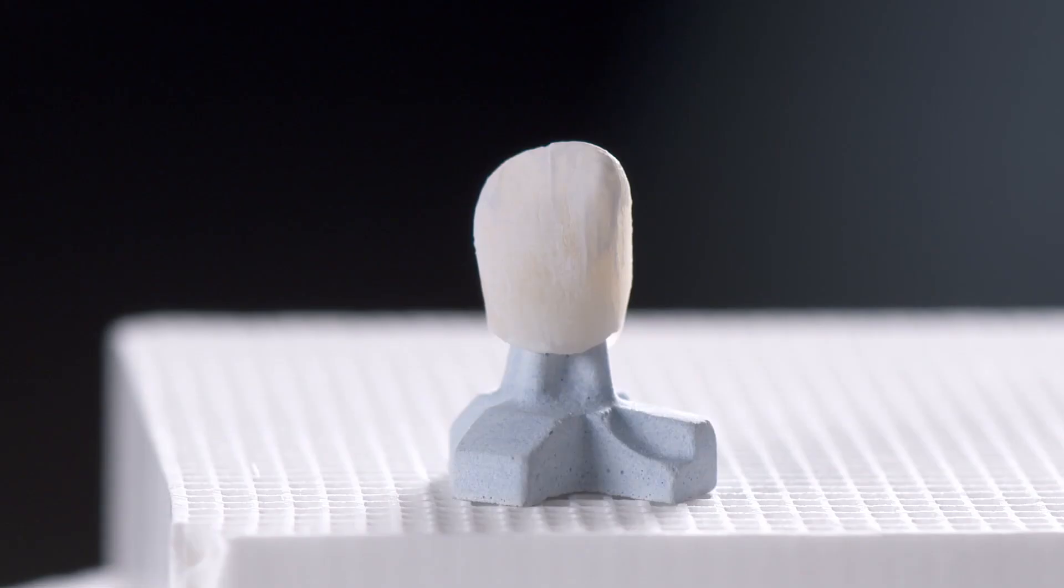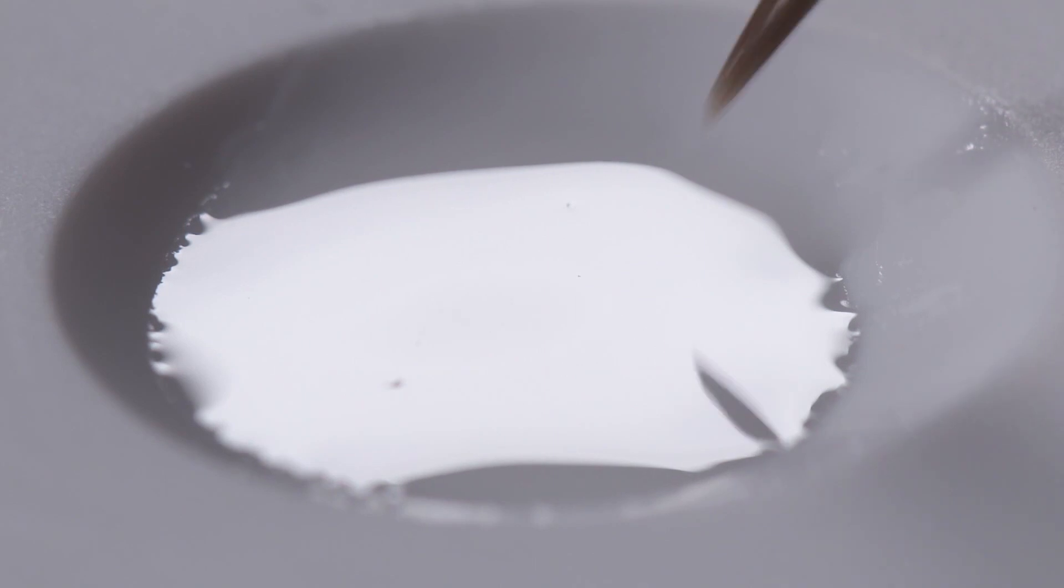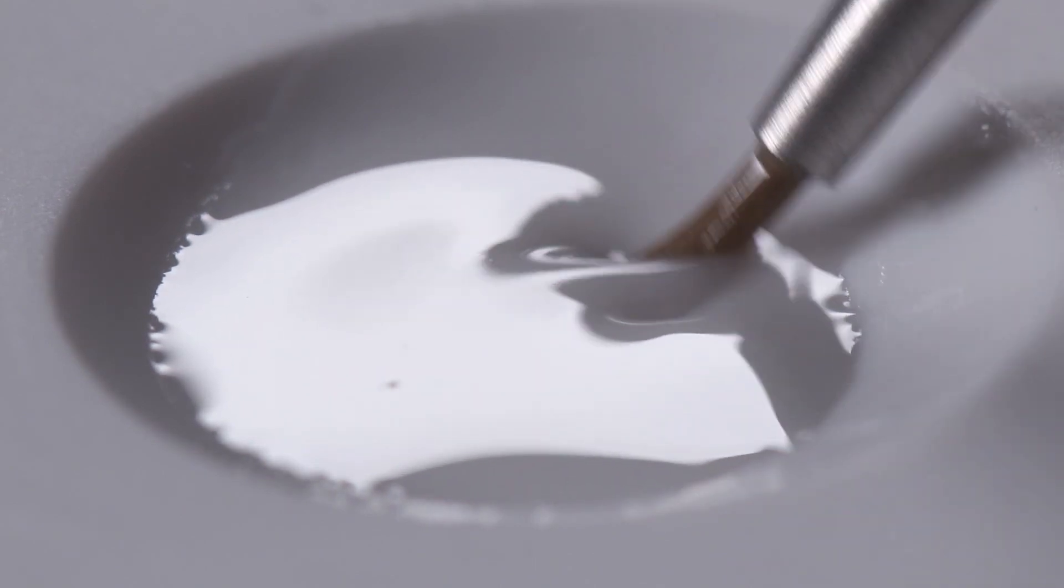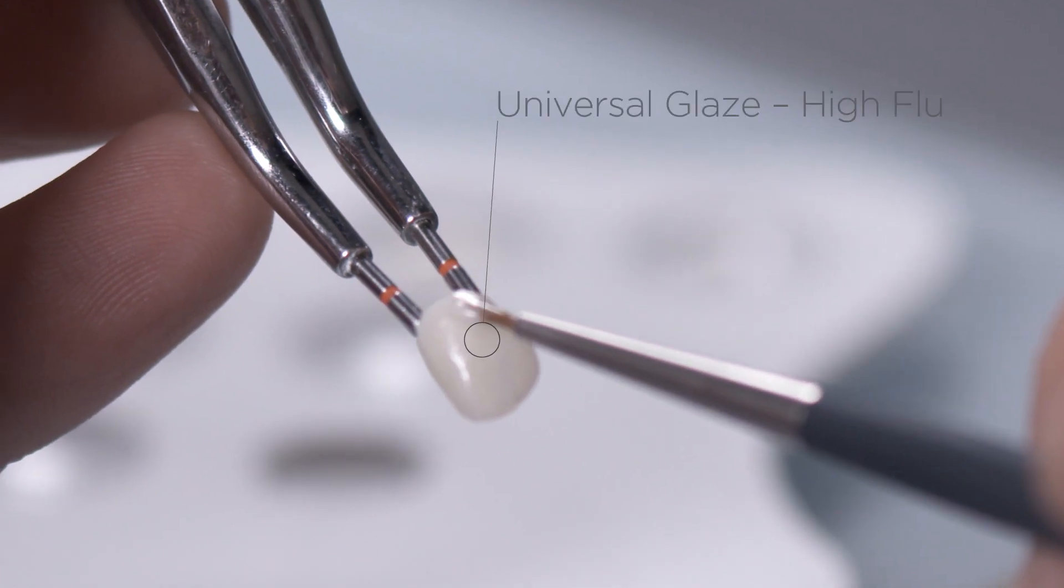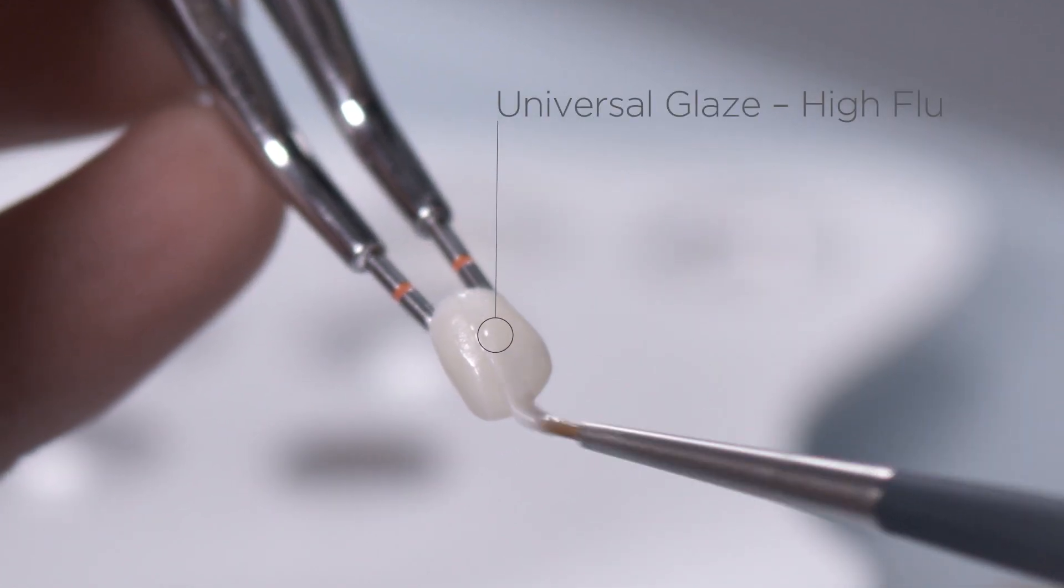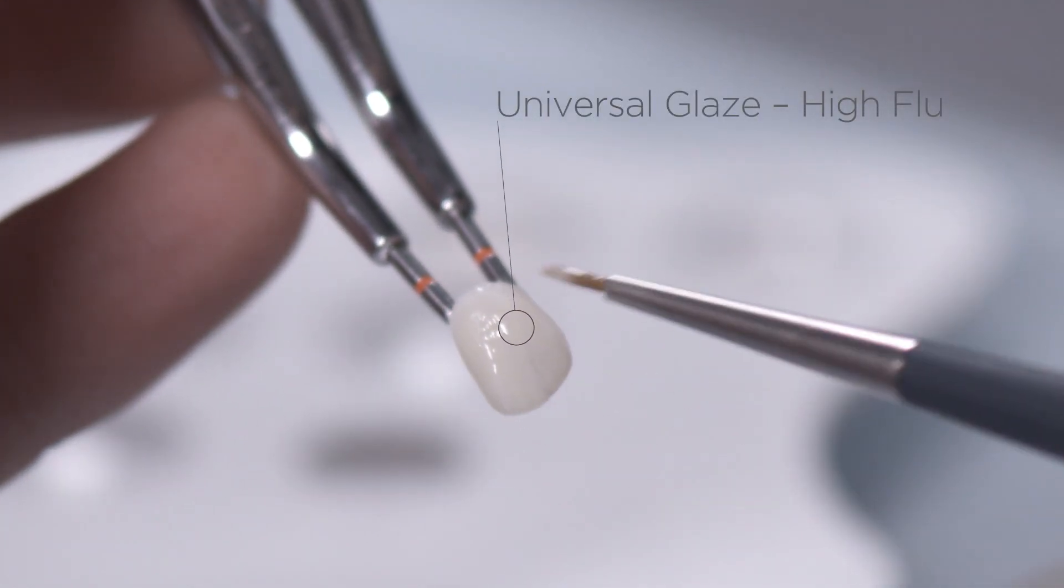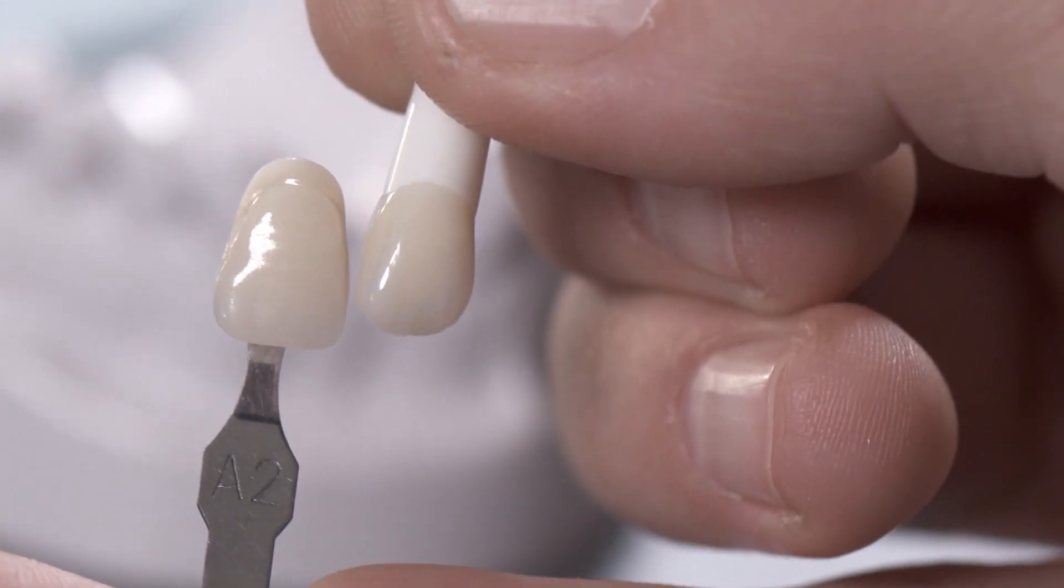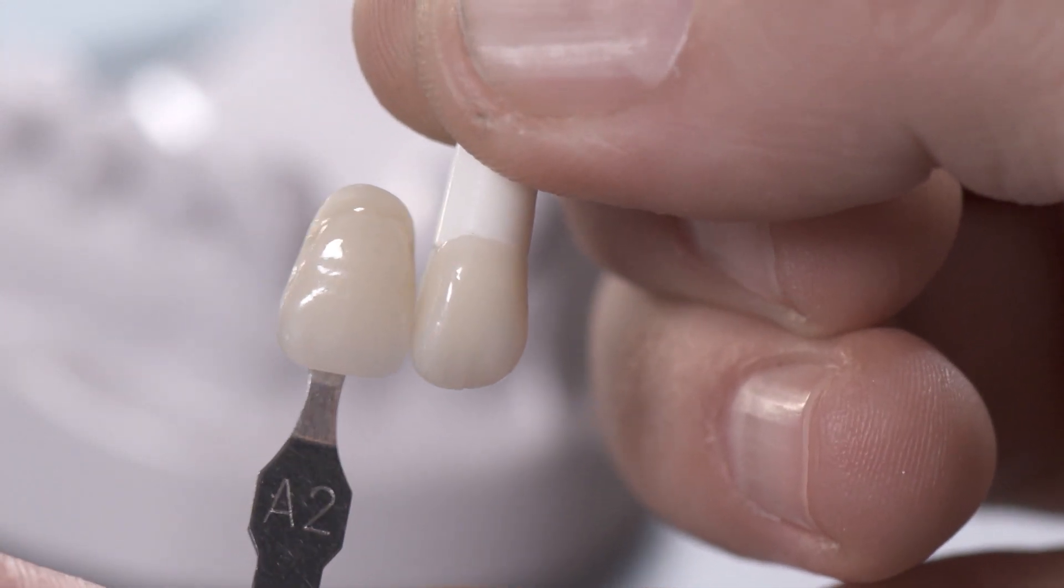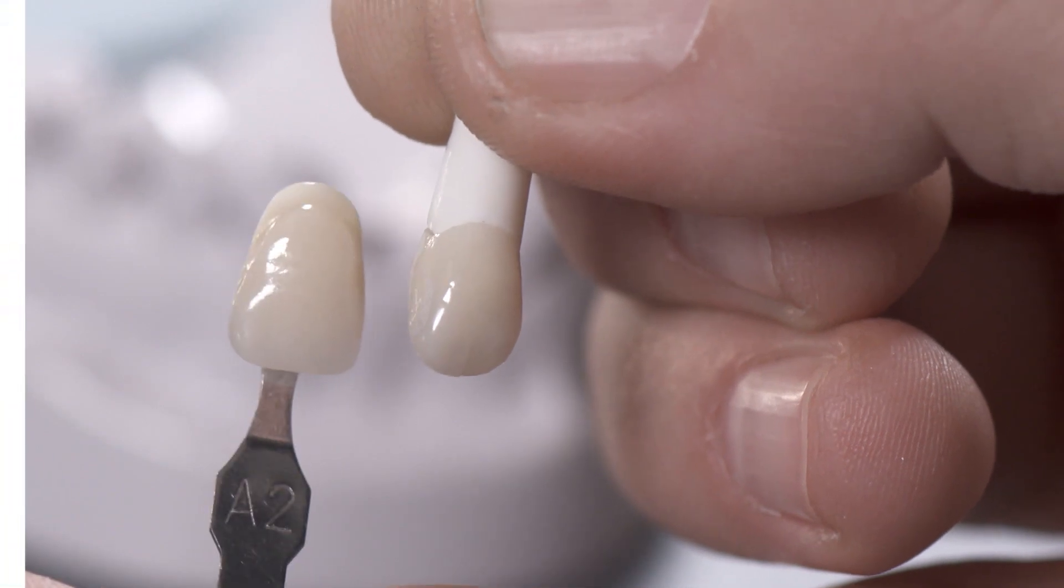After stain firing, only HIFLU Universal Overglaze is applied across the monolithic restoration. The final shade check against the shade tab confirms the quick and easy shade reproduction with great aesthetics.